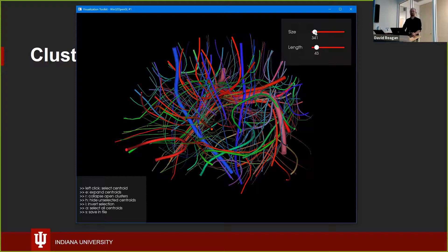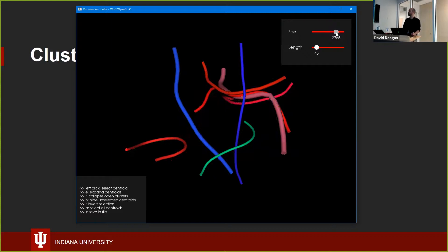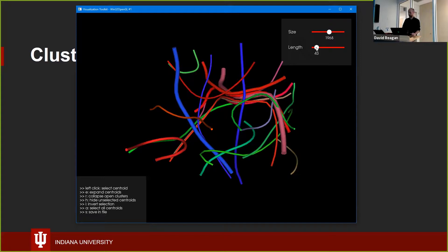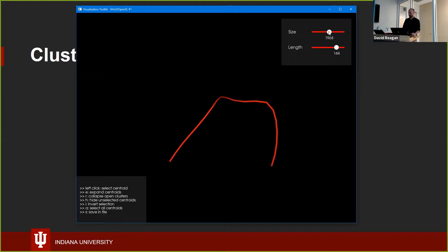I have a UI panel that I can grab. I'm going to filter the tracks by size — this is actually a maximum or minimum size filter. The bigger I make it, the more it filters out, so only the biggest and richest clusters are shown. This slider filters by length, so only the longest tracks are shown.